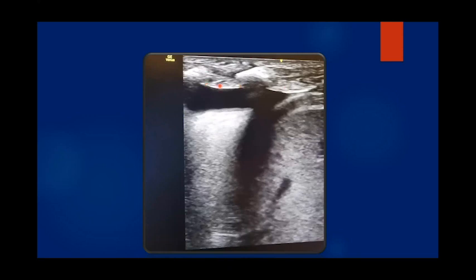Here is the pleural line. And what we can see here is a large dark area, which is fluid, and that's pleural effusion. Because the pleural effusion is large in amount, it prevents the lung from expanding, and it causes secondary compressive atelectasis. We can see here that this is whiter than usual. This is because of the collapse. Okay, so this is the effusion, as we said, this is the liver here, and this is the compressive atelectasis.